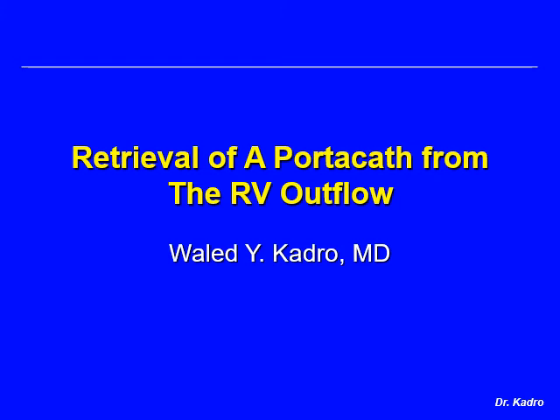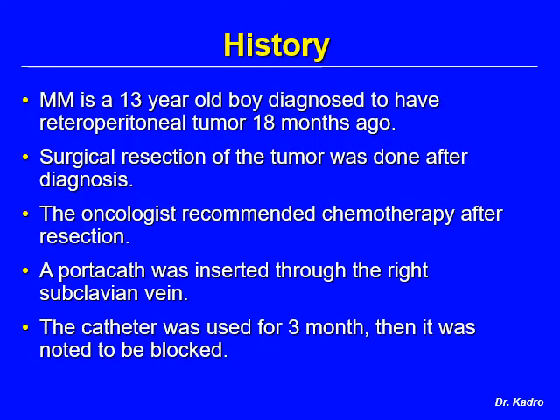This is Dr. Walid Kadro, consultant interventional cardiologist, reporting a case of retrieval of a portacath from the right ventricular outflow tract. This is a case of a 13-year-old boy diagnosed to have retroperitoneal tumor 18 months ago. Surgical resection of the tumor was done after the diagnosis.